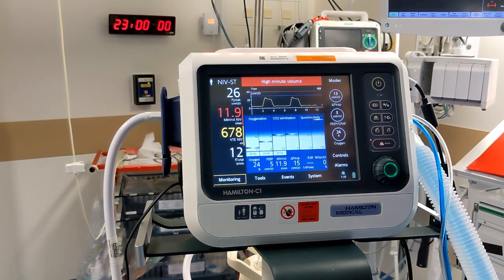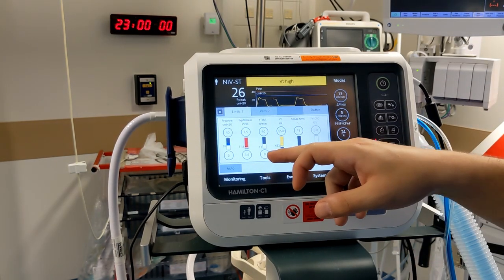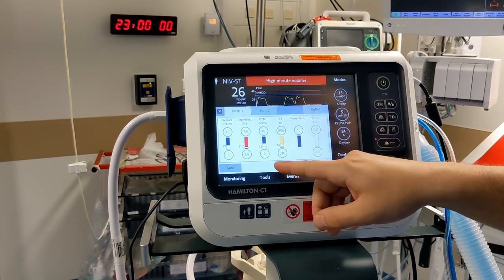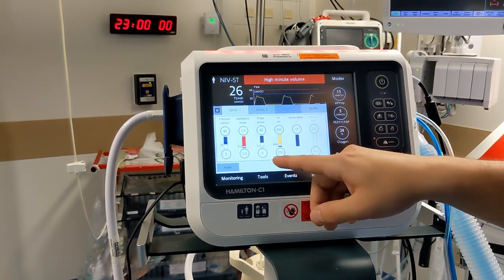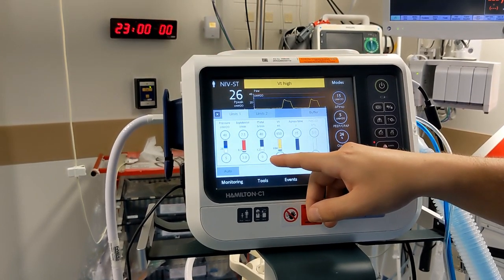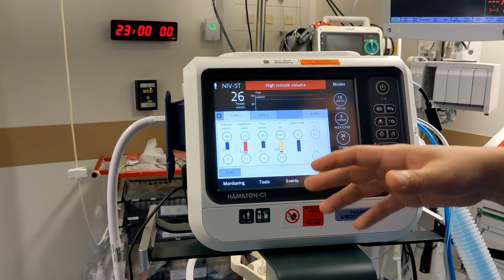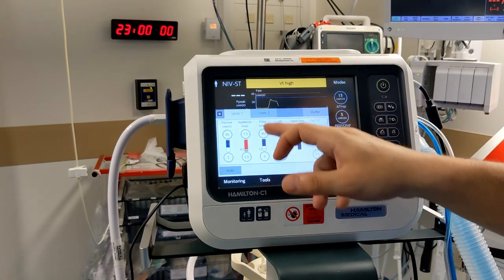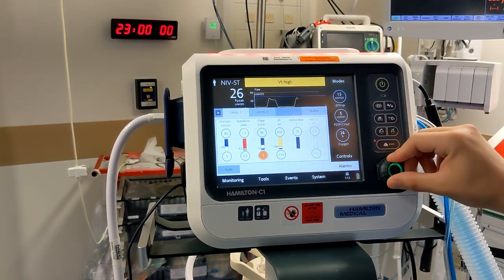The other thing worth mentioning on this machine is the alarms. If you go to Alarms, you will notice that the minimum breaths per minute that this machine will alarm on is zero by default. This means it will only alarm when the patient stops breathing entirely, which is too late. Whenever you set up this machine on a patient, go to Alarms and take the minimum breaths per minute up to at least 12.